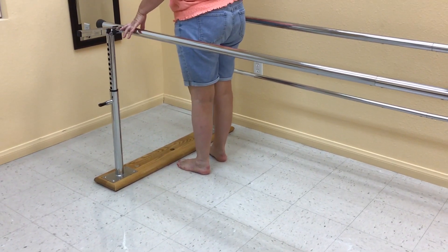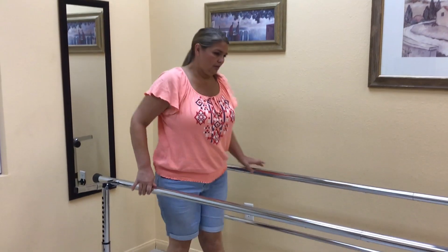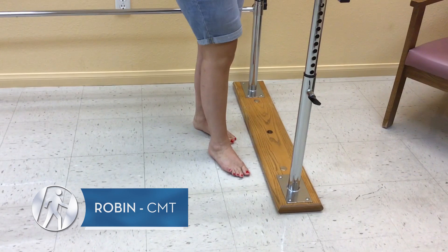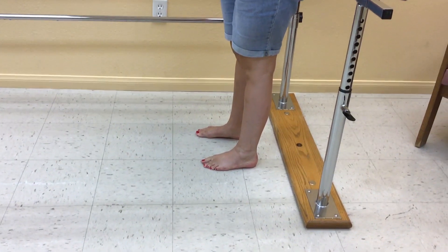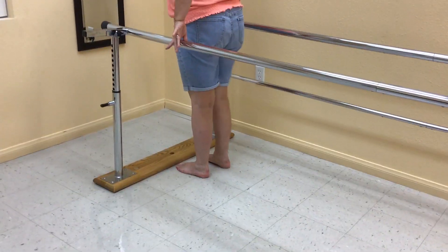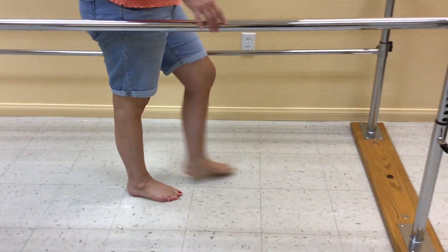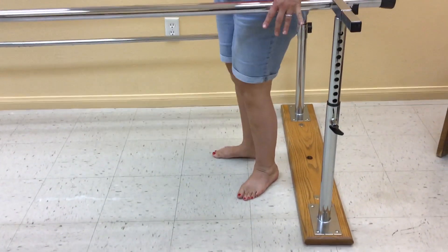Your right knee is hyperextending a little bit. When I walk, my left foot starts to drop more and more — like if we walk down that hallway. The right knee is hyperextending. What does that mean? It's going backward, and that could be why your right quads are a little weaker.